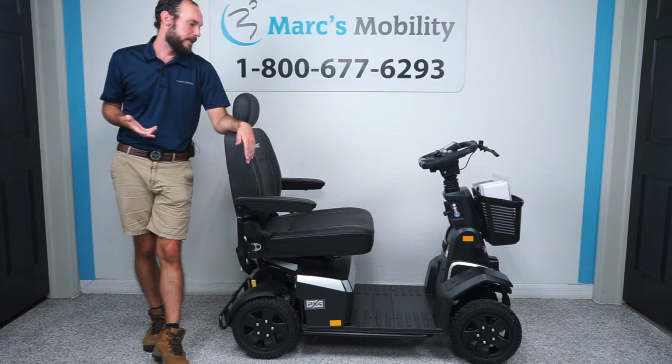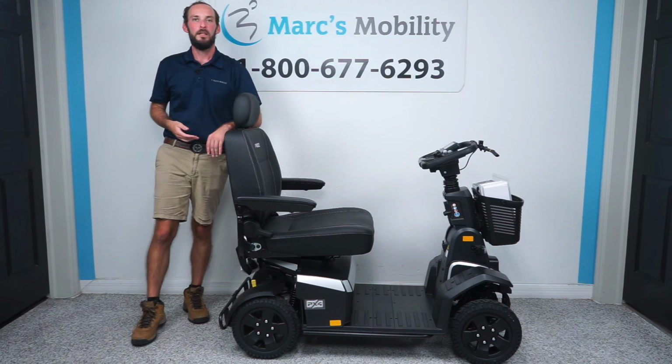But once again, this has been how to change the batteries in the PX4 by Pride Mobility.